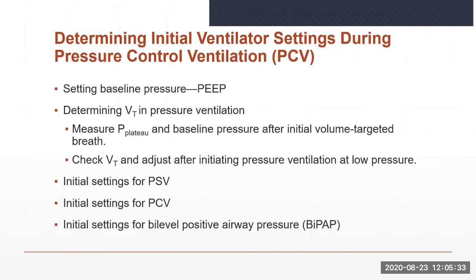In fact, not using a low level of PEEP may result in atelectasis. Use of low levels of PEEP may also be beneficial in patients with chronic obstructive pulmonary disease who would normally pursed-lip breathe but cannot do so with an artificial airway in place.